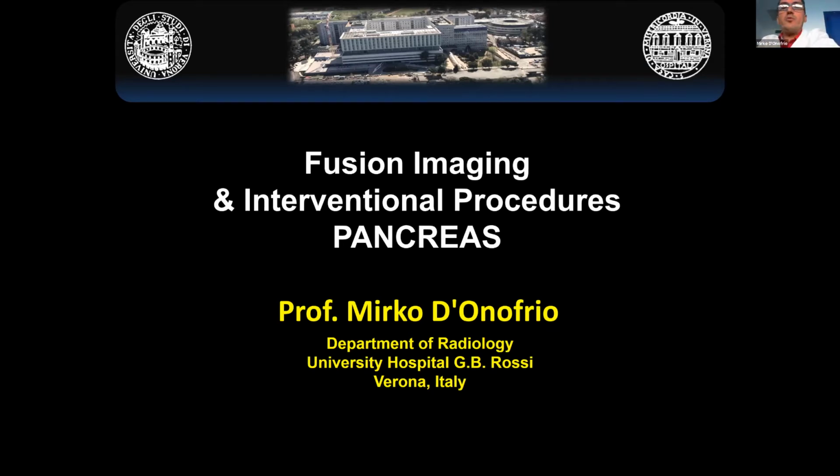So I will speak about fusion imaging and interventional procedures dedicated to the pancreas. First of all, let me say that fusion imaging is really a new imaging technique. We can use CT or MRI on one side, and on the other side we can use normally conventional ultrasound, but why not also Doppler techniques? We can add contrast ultrasound during our fusion imaging.